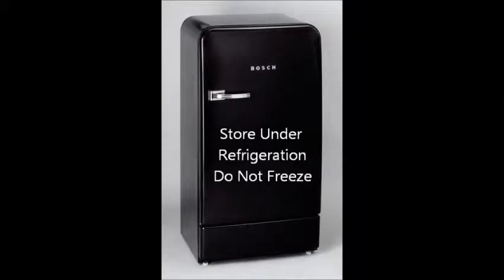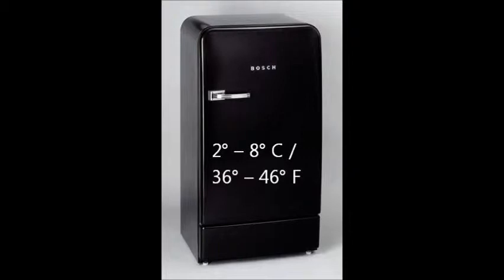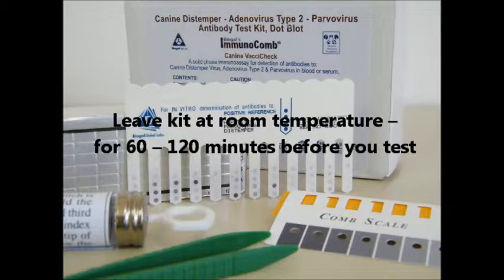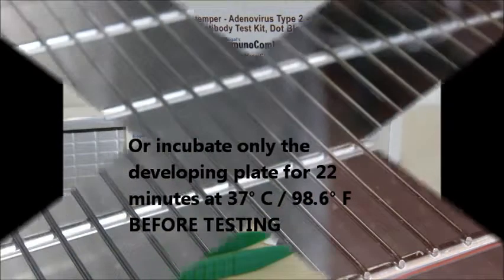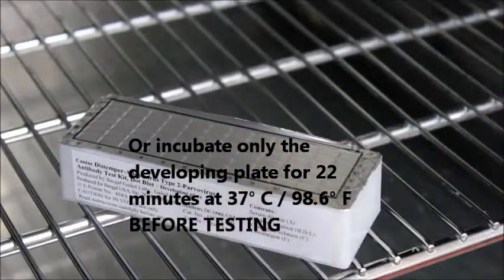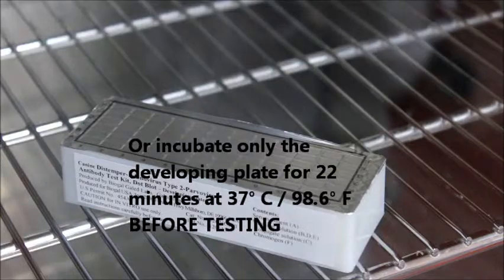Firstly, it is important to store the kit under normal refrigeration, and that means 2 to 8 degrees Celsius or 36 to 46 degrees Fahrenheit. Do not freeze this kit. Before conducting the test, ensure that all the kit elements and the specimen to be tested are at room temperature for at least 60 to 120 minutes before you actually test. You can speed up this process if you incubate only the developing plate for 22 minutes at 37 degrees Celsius or 98.6 degrees Fahrenheit.